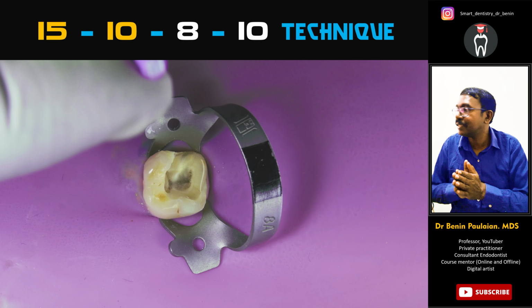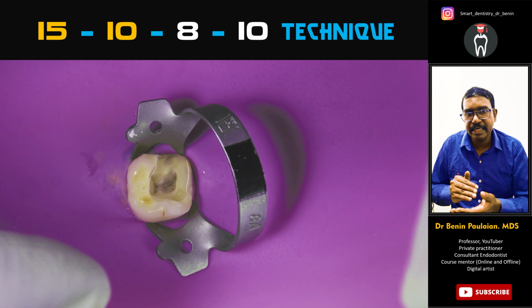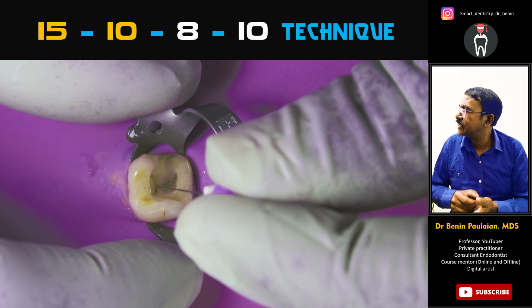You may wonder that we are not sure of the working length. So at this stage, you can use the tentative working length or the average length of the tooth. For example, a mandibular molar will have a length around 19 to 20 millimeters in most clinical situations. So following that, we can divide it by 3 and you can negotiate depending upon that.